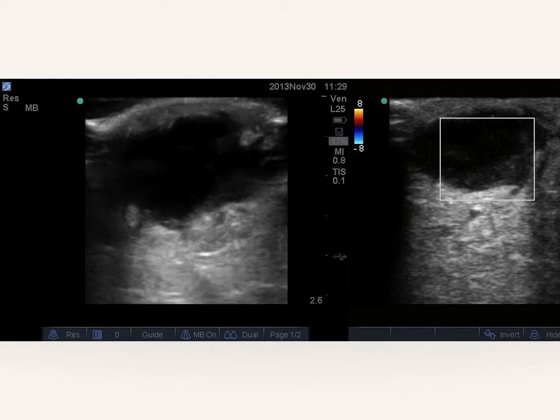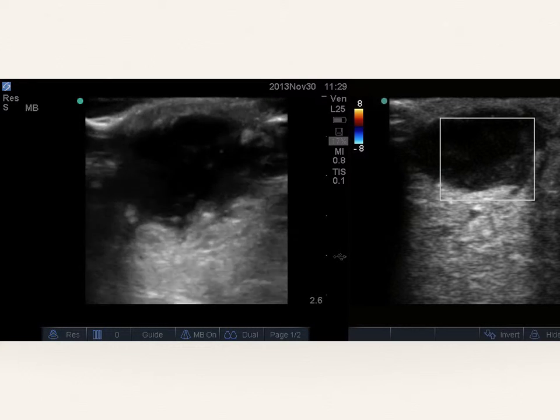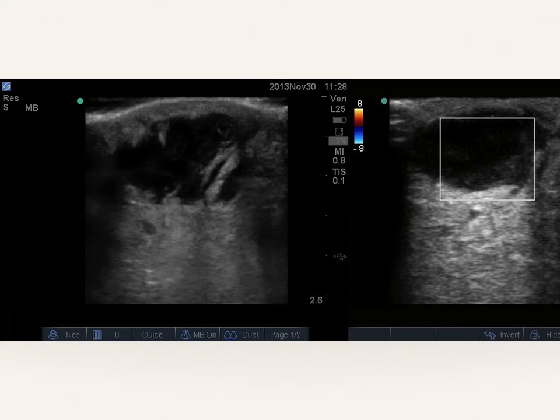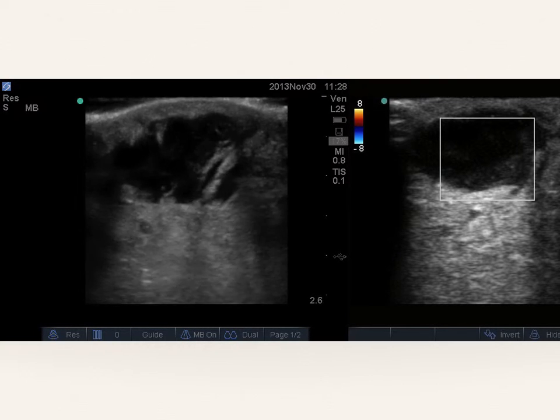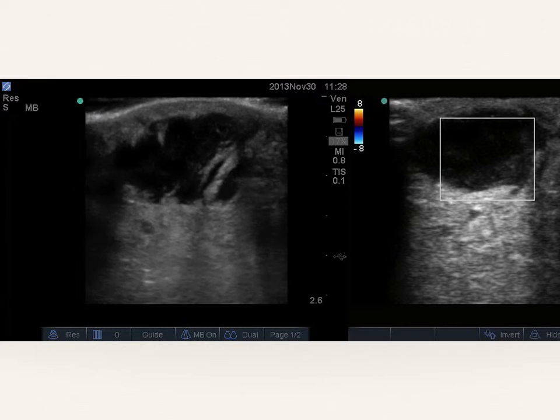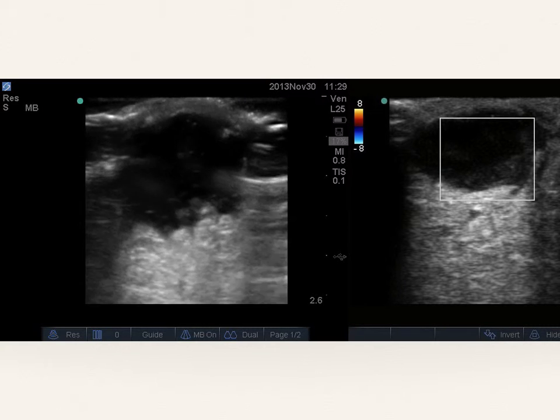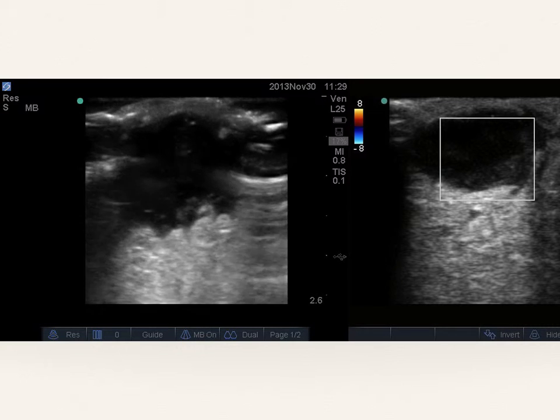How about this area in a young man with a painful and reddened area to his right axilla? So there appears to be a fluid collection with irregular borders. Is there posterior acoustic enhancement? Yes, there is. The area behind this fluid collection in the video appears brighter. Now, we don't have a swirl sign in this clip, but there does seem to be echogenic debris within it.